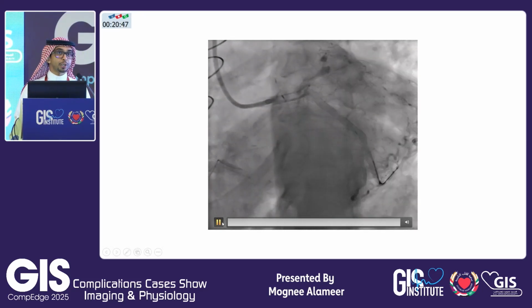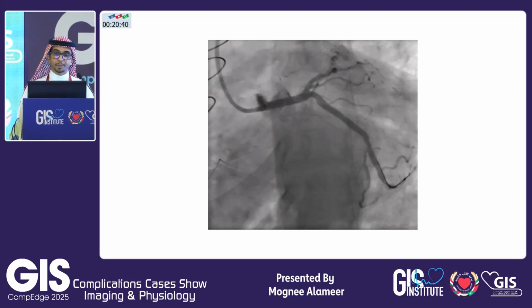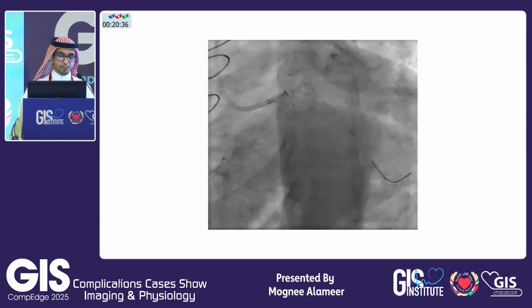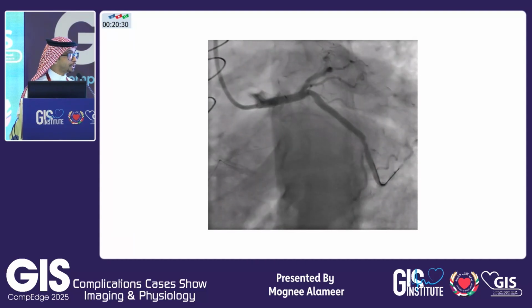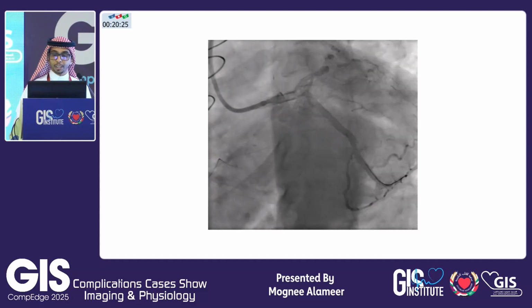I reviewed the chart. I found the patient came in July to her MRP, just complaining of exertional shortness of breath, class 2, and he ordered a nuclear scan. So the lesson from this case, actually: no left main PCI without imaging. If they did imaging at that time, they would recognize the dissection and they would not leave it.